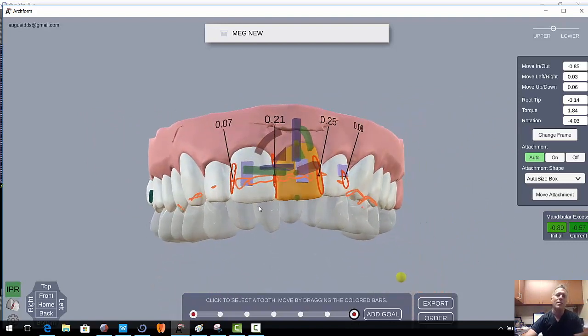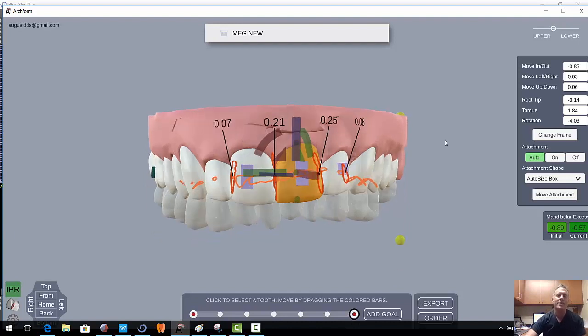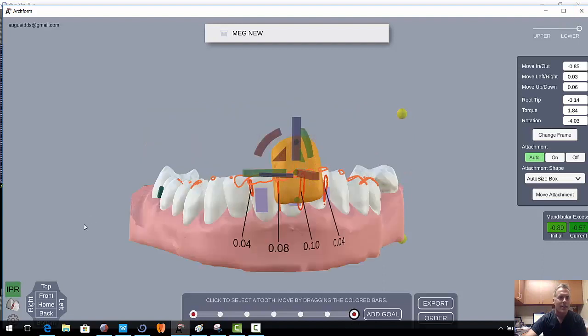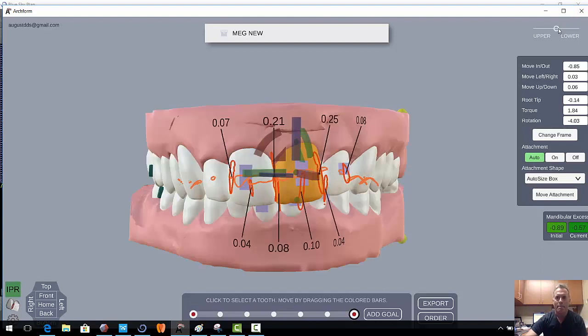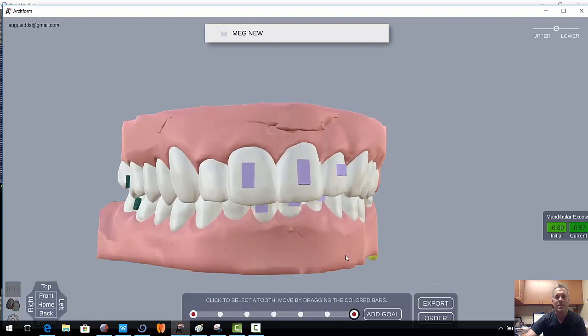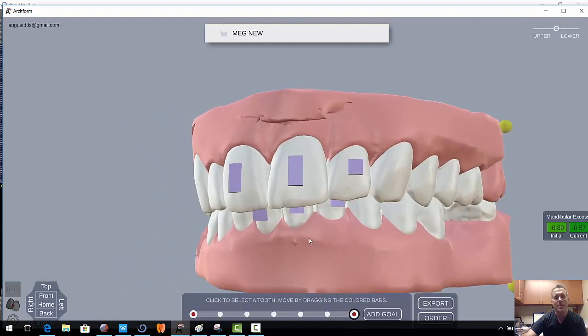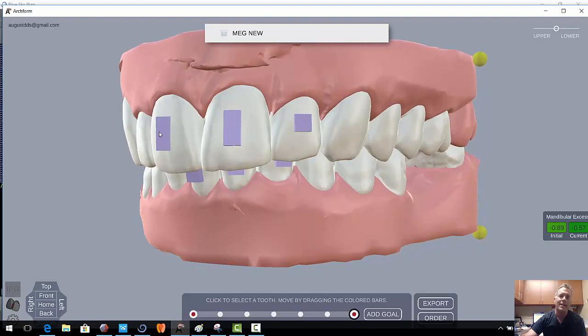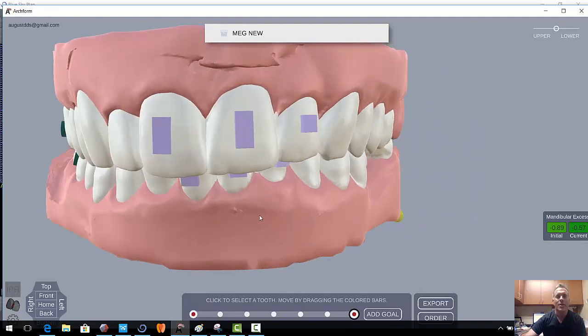All right, so once we're happy, we can go ahead and export this case. I'm not going to export it because I've already done that. But let's go ahead and turn everything on. And we can turn off some of these numbers and just kind of take a look. One thing I didn't mention, which is a pretty cool function, is we have automatic attachments.